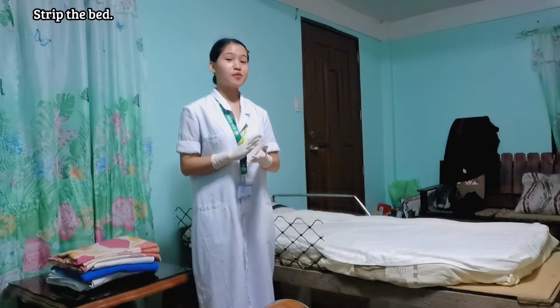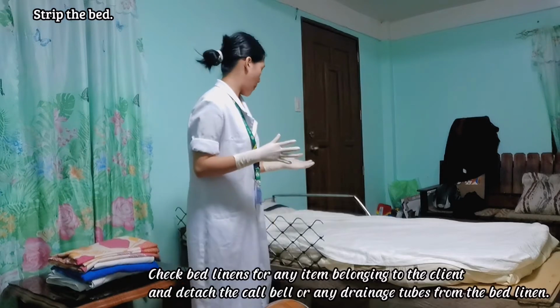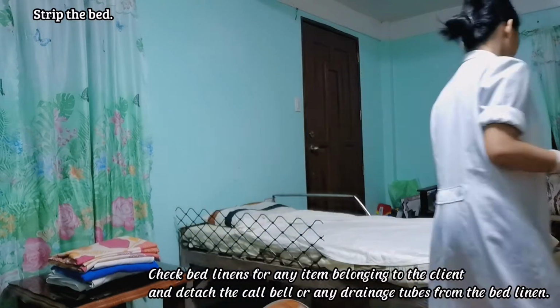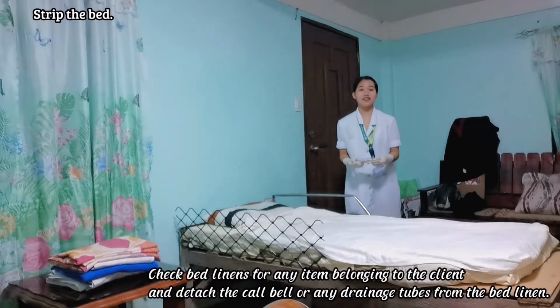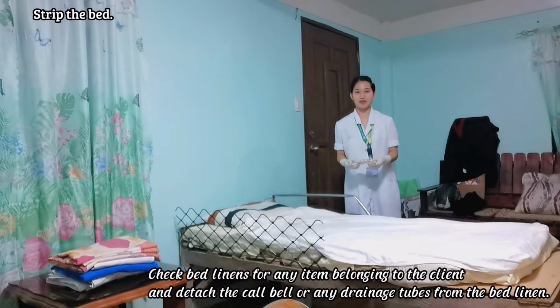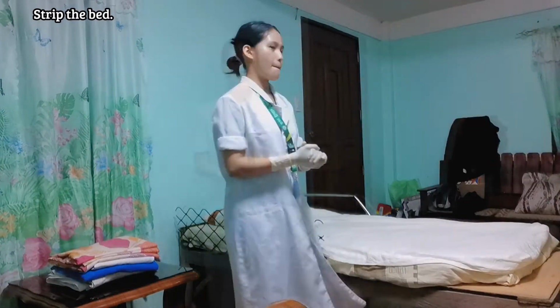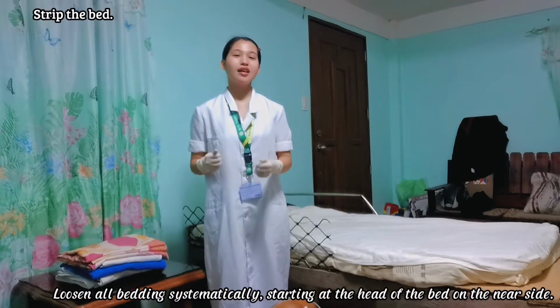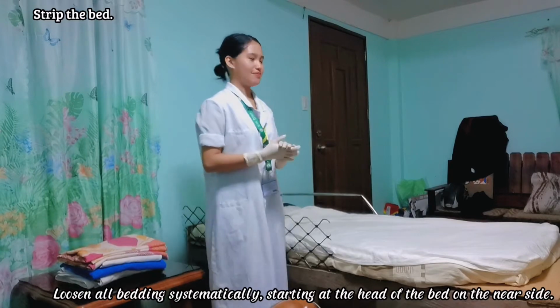After that, I'm going to perform hand hygiene and don a pair of gloves. The next step is to check the bed linen for any item belonging to the client and place them in a secure place of the room. Then we're going to loosen all the bedding systematically, starting at the head of the bed on the near side.